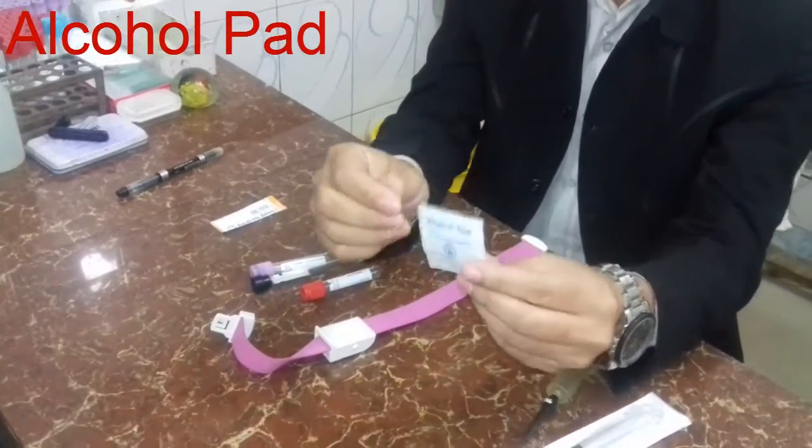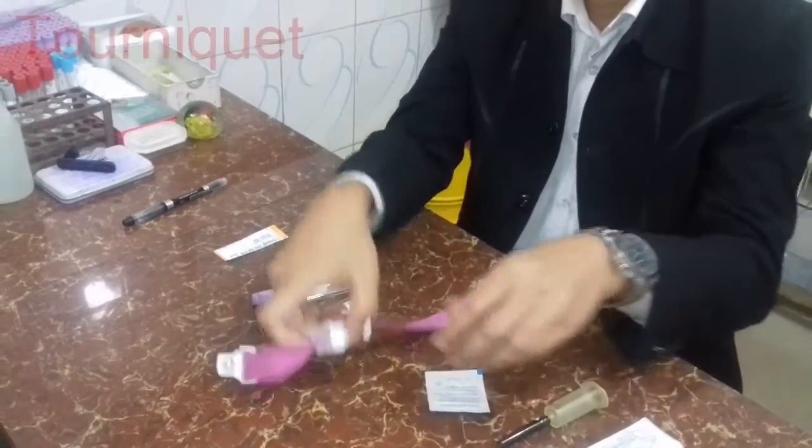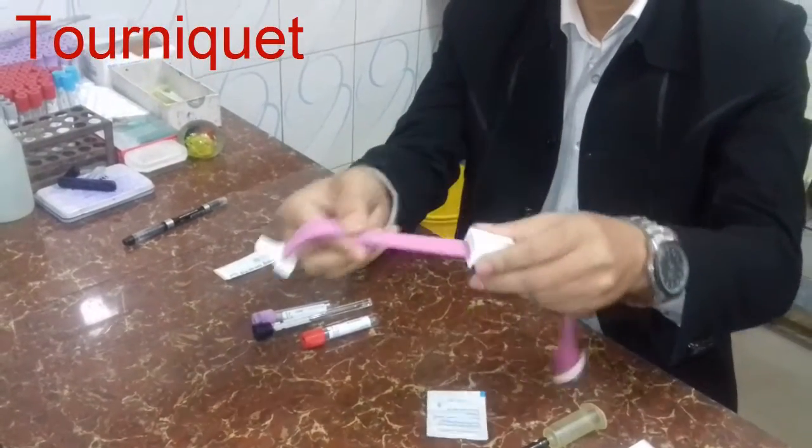It is to see the alcohol pad. It is to see the tourniquet.